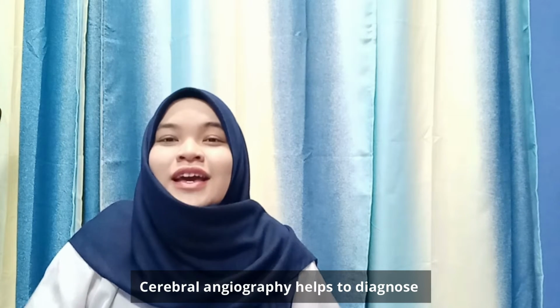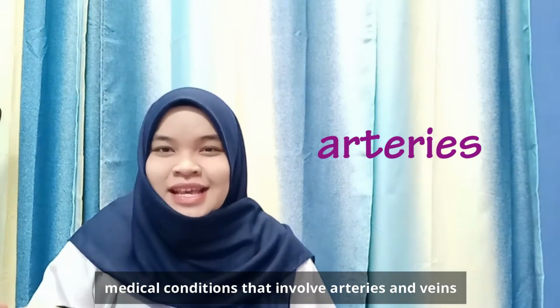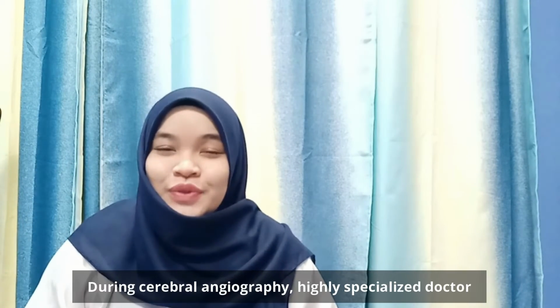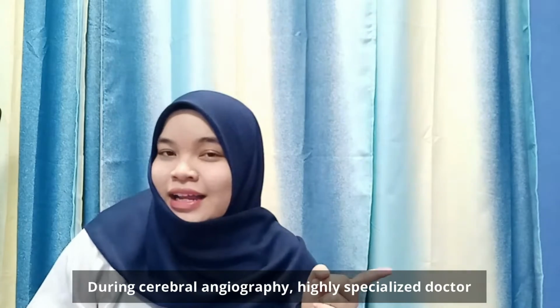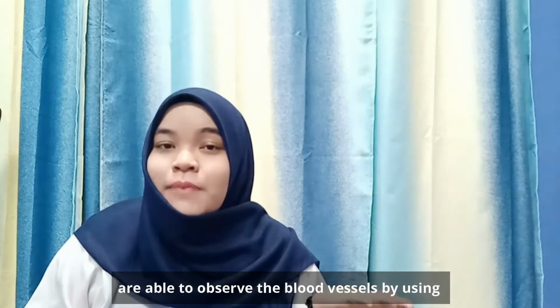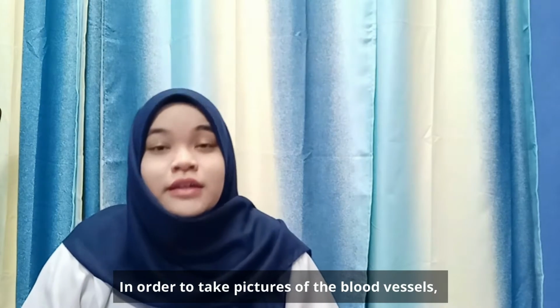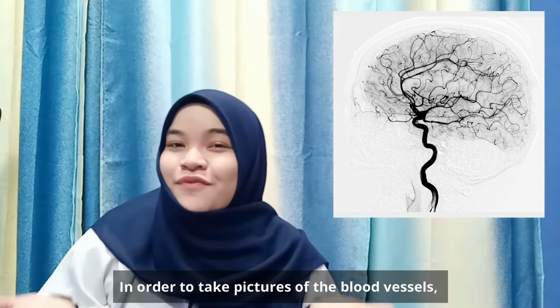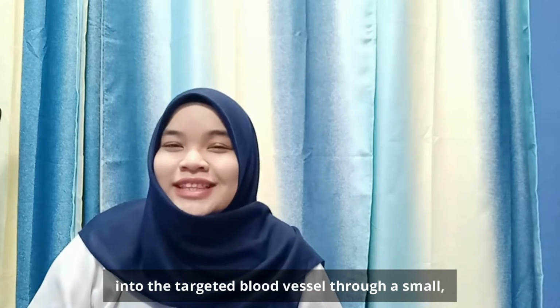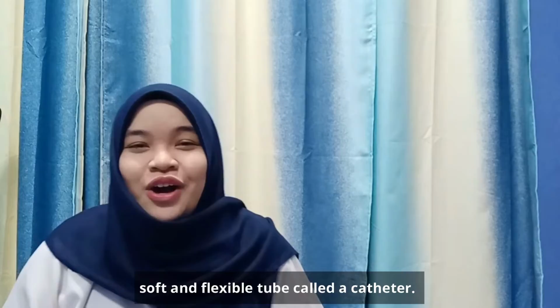Cerebral angiography helps to diagnose medical conditions that involve arteries and veins in the head and neck, including the brain. During cerebral angiography, highly specialized doctors are able to observe the blood vessels by using modern sophisticated imaging equipment. In order to take pictures of the blood vessels, a contrast medium or dye is injected into the targeted blood vessel through a small, soft, and flexible tube called a catheter.